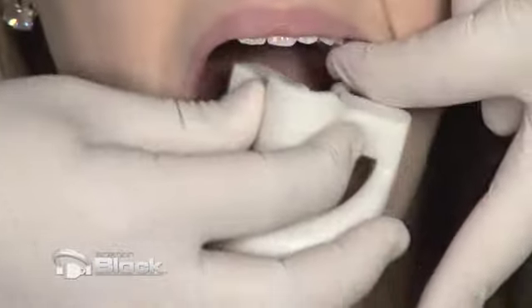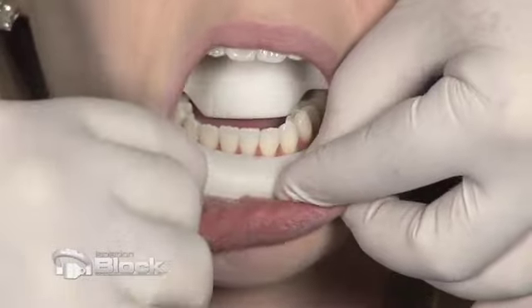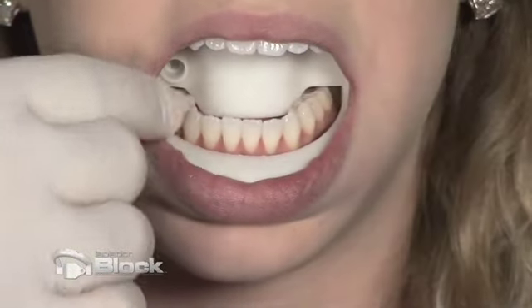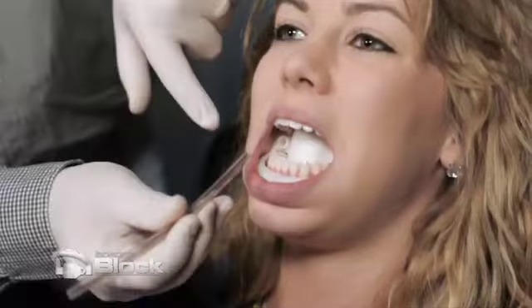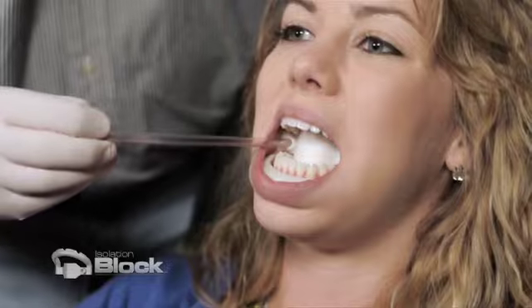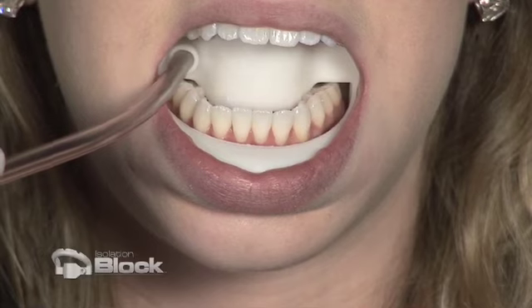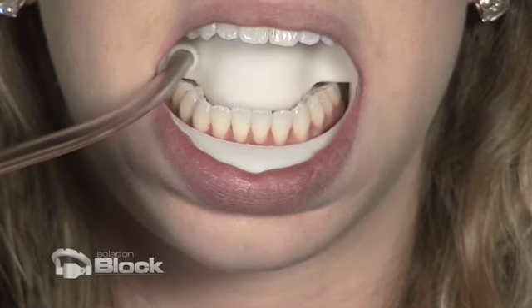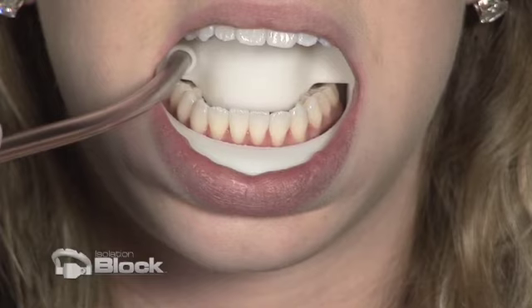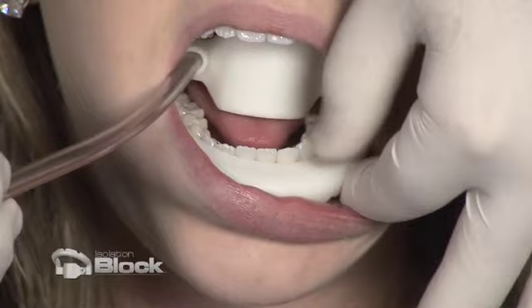Same thing, you squeeze the tongue shield, have the patient open. Once you have it back in place, you have the patient bite down slightly and pull the lip out around the lip retractor. The saliva ejector just plugs right into the front again and connects to the low volume suction. And again, as you can see, the patient's just resting on the bite block. The tongue shield keeps the tongue retracted back out of the working area, and the lip retractor keeps the lower lip out off the facials of the teeth. Again, in removing it, you just have the patient open slightly, and the product just slides right out.